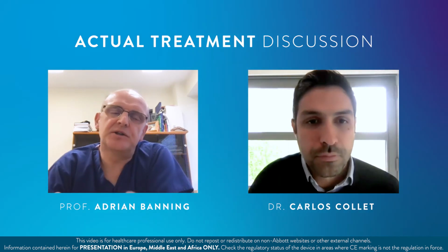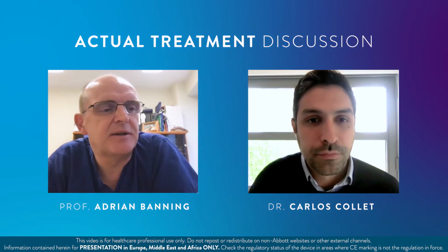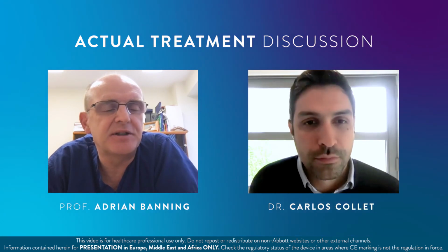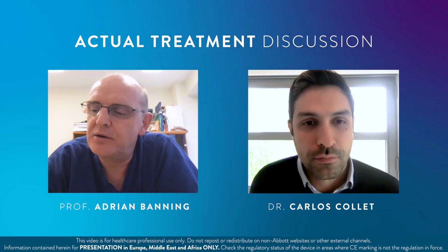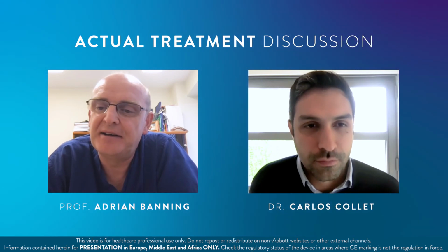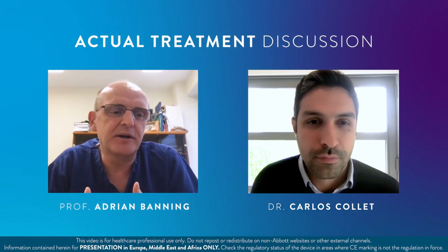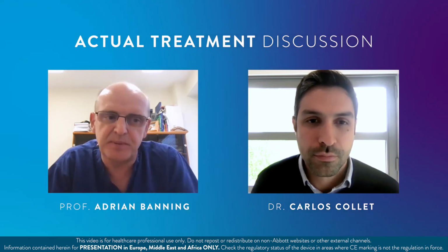I mean, the other thing which is quite nice is that you accepted a little bit of a dissection distally on the OCT without feeling the need to put another stent in. And one of the criticisms of OCT is that we see too much and that we are driven consequently to put in stents when they're not necessarily required, and that we can see small dissections, and perhaps less experienced colleagues might be tempted to put more stents in just because there's a dissection. Do you want to make a comment on that, Carlos?